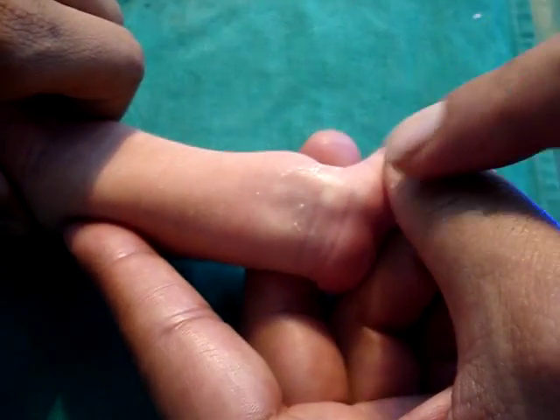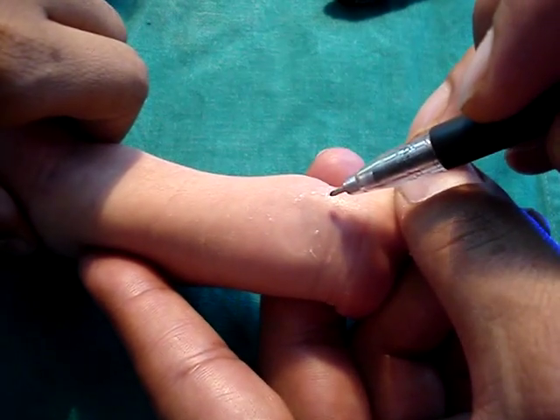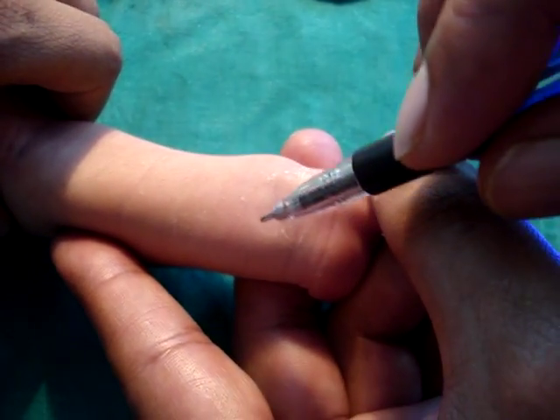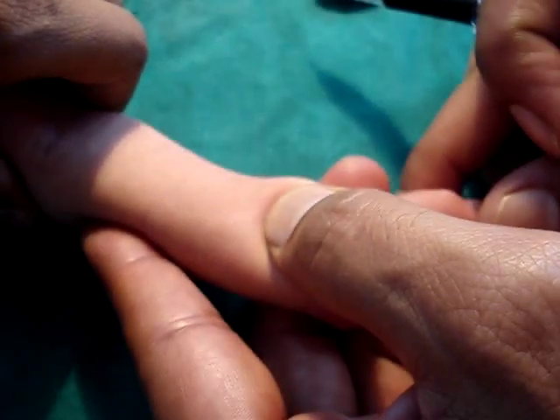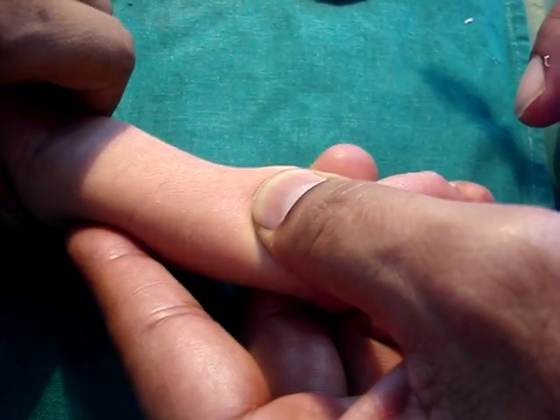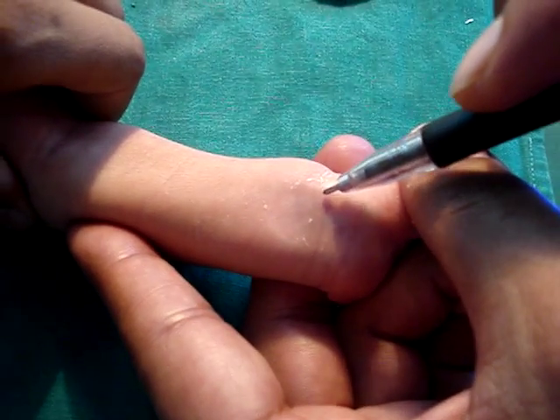You can see that now the radial artery is visible here. There is a shining part and a little shadow is formed here — this is the depressed area. I will apply pressure once more over the radial artery side for about 30 seconds, and after releasing, the artery becomes prominently visible with a shadow by the side.